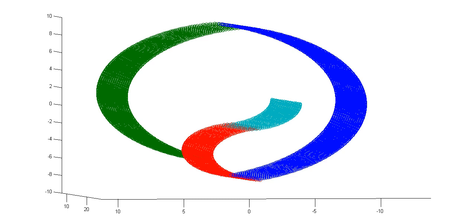Doing the subtraction. So if they're very balanced and equal, you'd have a big input and a big bold signal in the comparison region, but you'd have little spiking in that region because the difference would be around zero. In that case, the actual spiking of that area would be nothing if the two things are canceling each other out. But the bold signal would say that there's a lot. So it's not necessarily a problem if you know what the bold signal is doing.